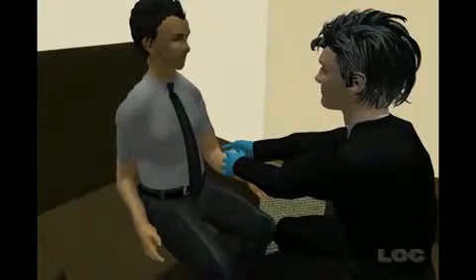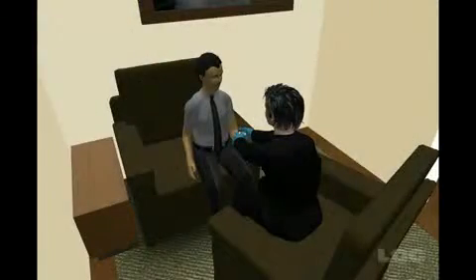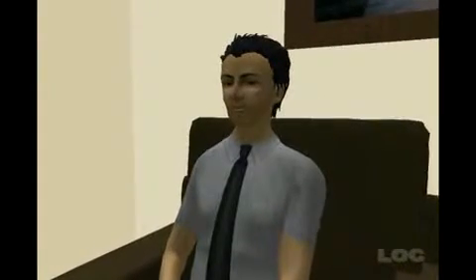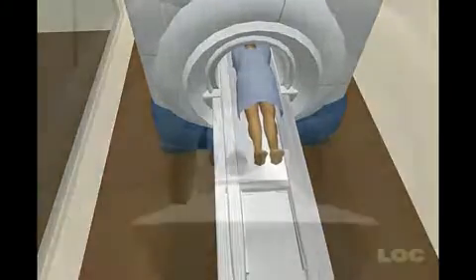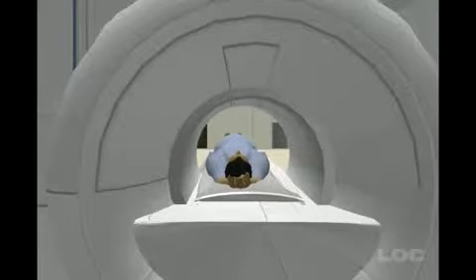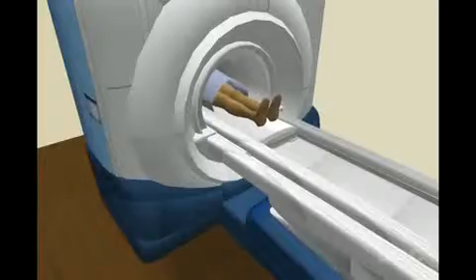About an hour before the scan starts, a small needle is inserted into your arm for the injection of the radioactive substance. The time is necessary for the radioactive substance to be taken up by the tissues. Unlike the CT and MRI scans, you usually go into the scanner head first. You go into the scanner twice. The first time is to get the CT scan, and the second time to get the PET scan. The CT scan takes just a few seconds, but the PET scan takes around an hour.